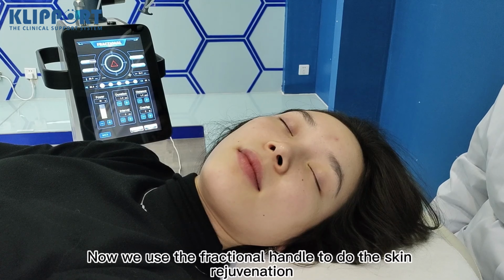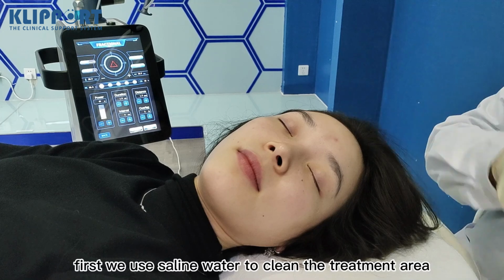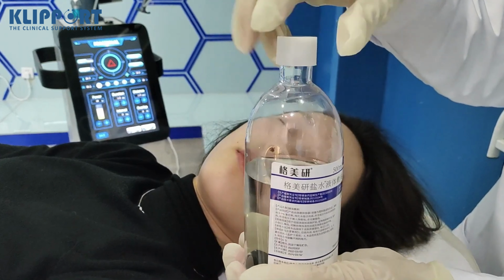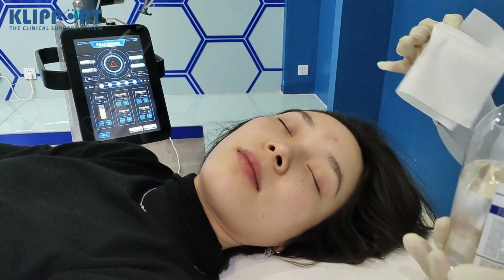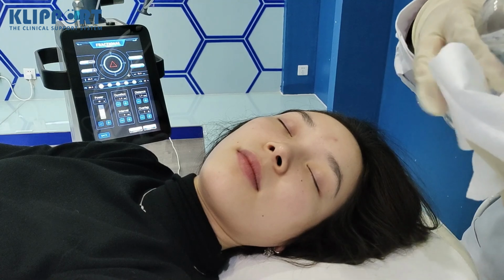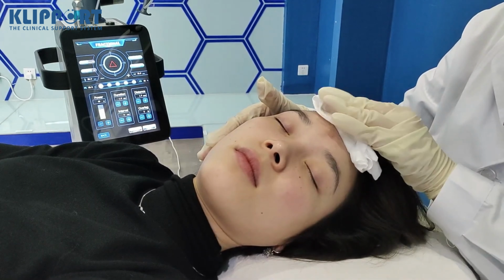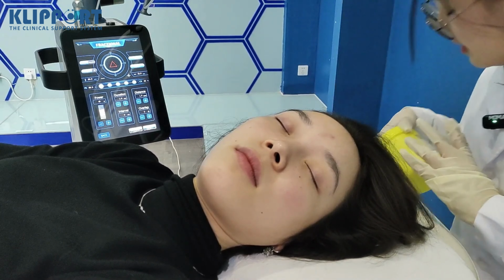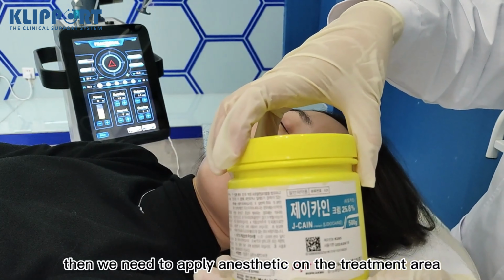Now we use the fractional handle to do skin rejuvenation. First, we use saline water to clean the treatment area. Then we need to apply anesthetic on the treatment area.